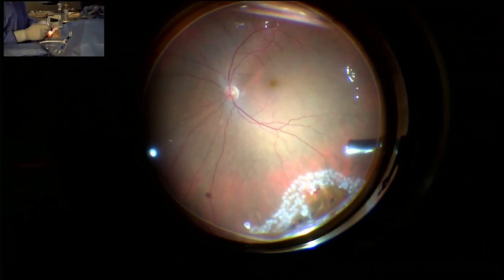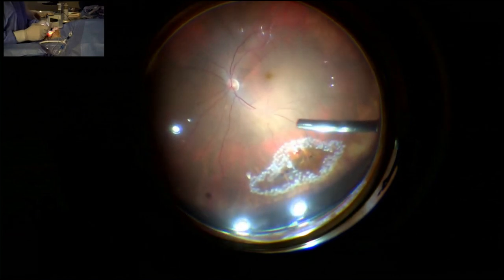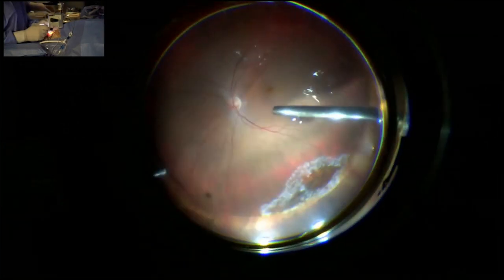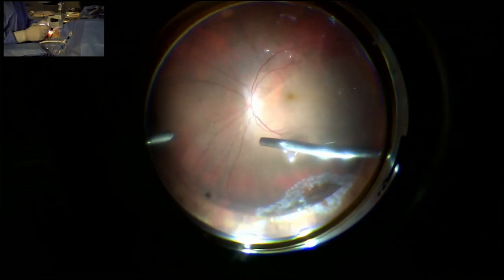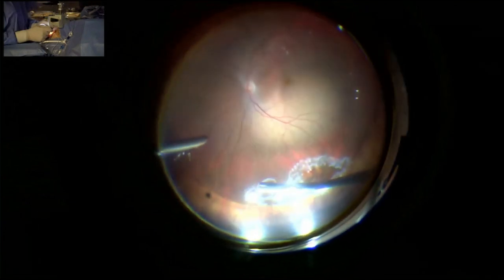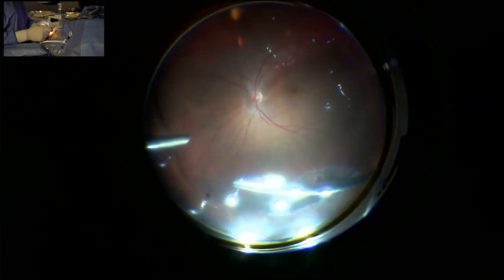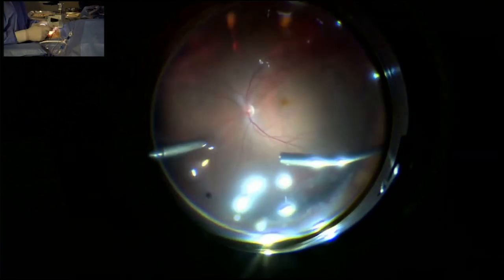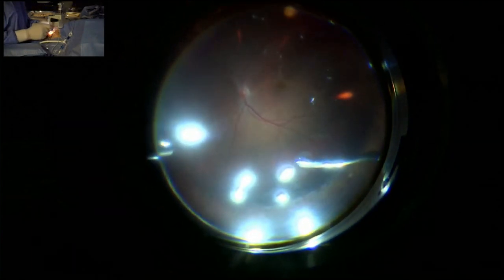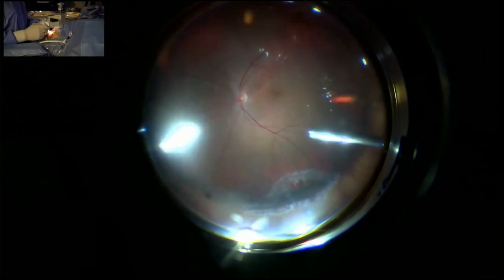Professor, could you tell us the gas concentration you will use? Usually, if the retinal tear is in the superior part of the retina, as in our case, I prefer 8% C3F8, but you can also prefer maybe 12% SF6. In my practice, I don't like to use different kinds of gas, and therefore I use only C3F8 and only vary the concentration for the duration of the gas in the vitreous cavity. In this patient, I will use 8% C3F8. But if the tear were in the inferior part, I would use 10% C3F8.